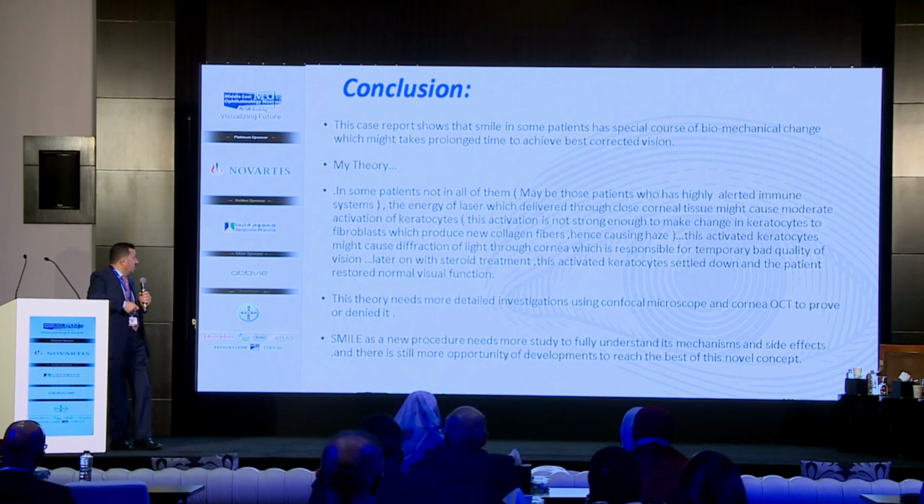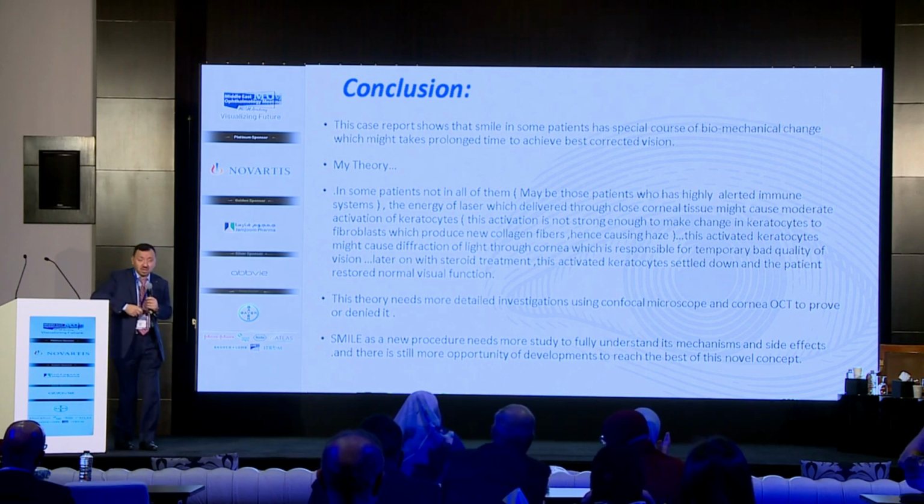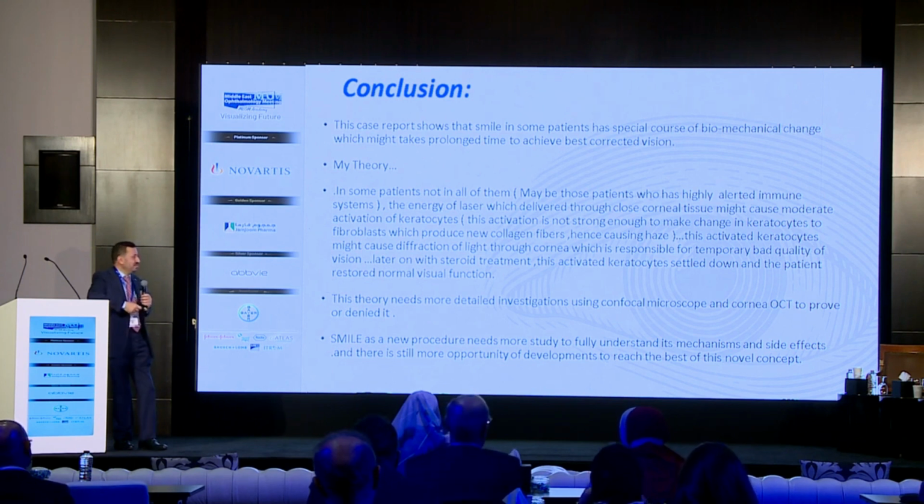So to conclude in this case, I do believe that waiting and giving time with careful monitoring sometimes might be a good option for the patient and avoid the surgeon some complication. And at that time, I would say SMILE still has a lot of things which we are not fully aware of. Of course, we are still learning, and we are looking for the perfect procedure, which is yet to come one day. Thank you very much.